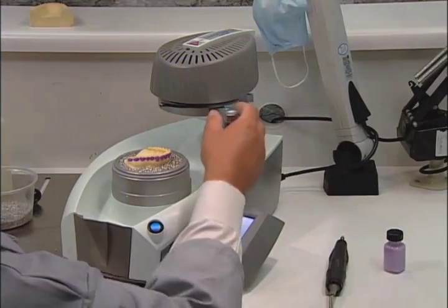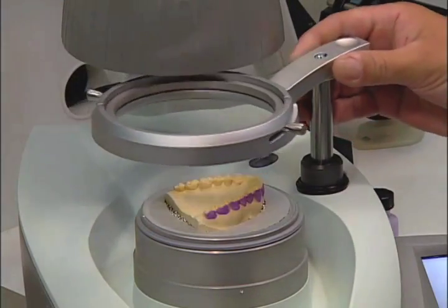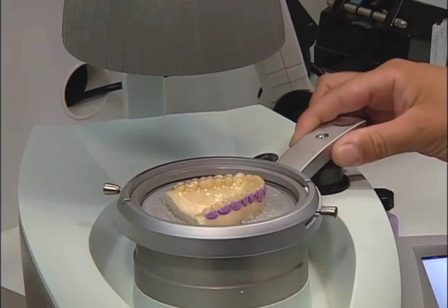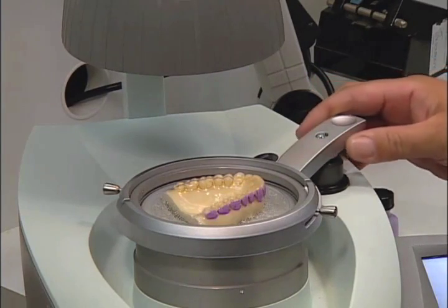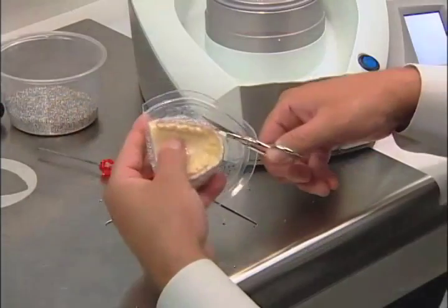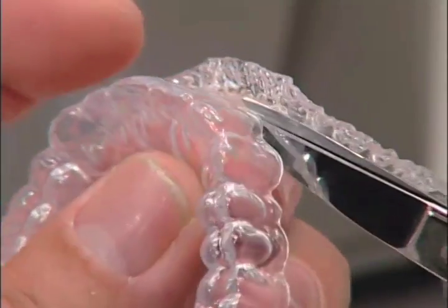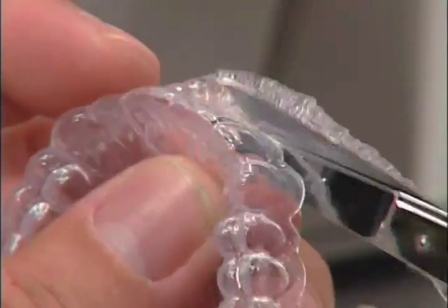Place the foil frame under the heater. When the audible signal has sounded, move the foil frame over the model and seat it to thermoform the tray. Remove the tray from the model and begin cutting your desired dimension from the ErcoFlex material using the special scissors.